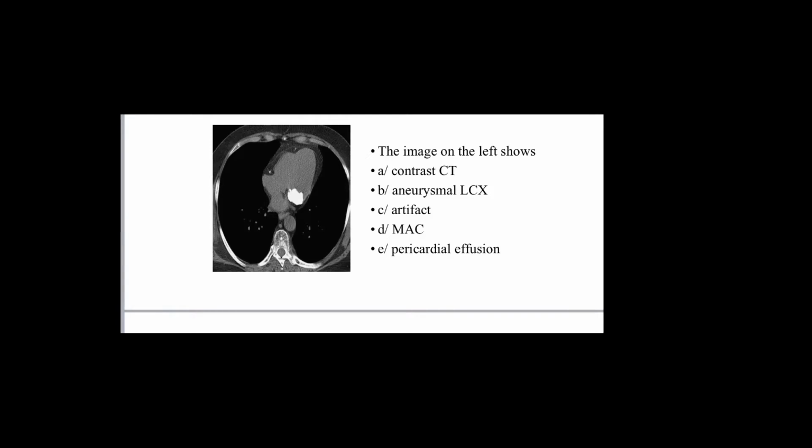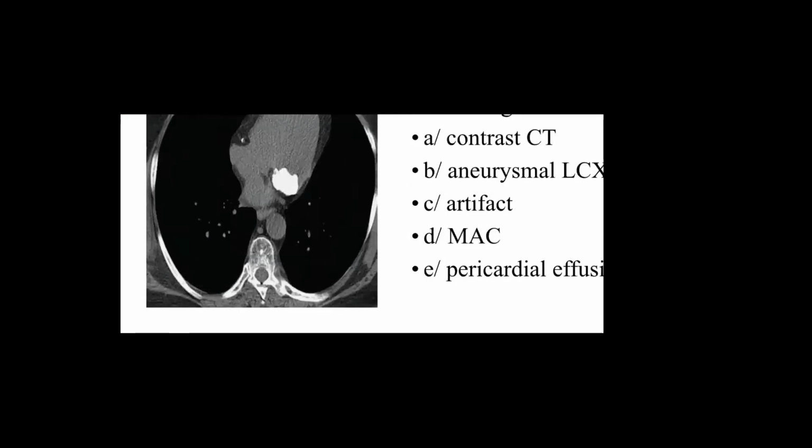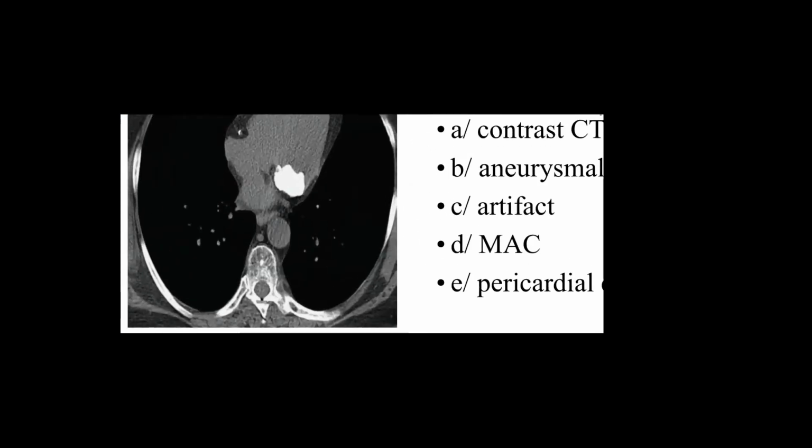This is exactly the mitral annular calcification. This is a significant amount of MAC, but because cardiac CT is best in depiction of calcium, it looks like that. Okay, so this is mitral annular calcification. This is non-contrast CT. No contrast is given yet.